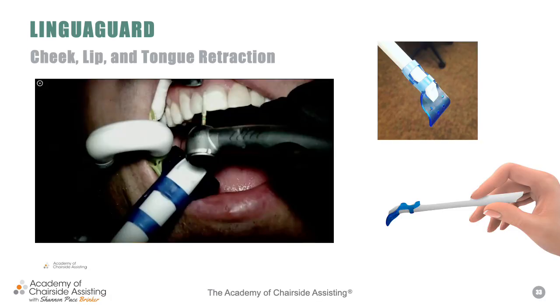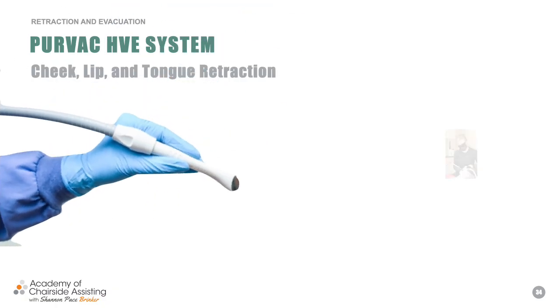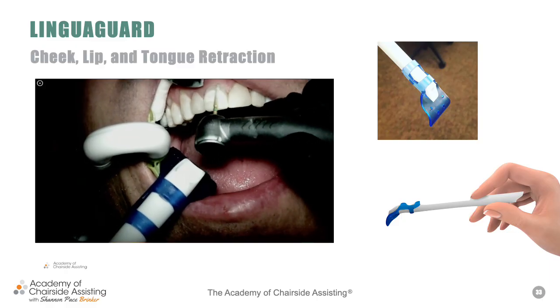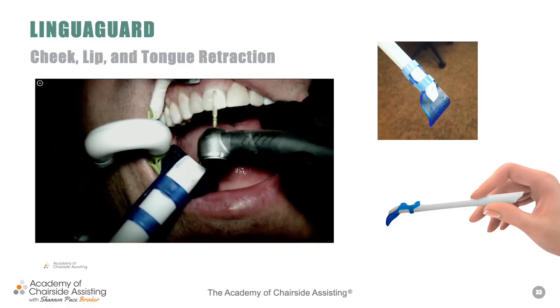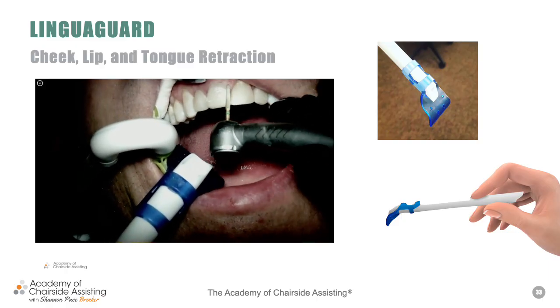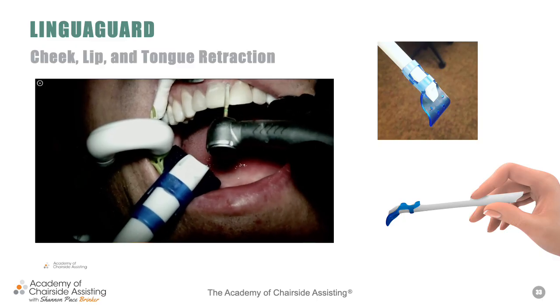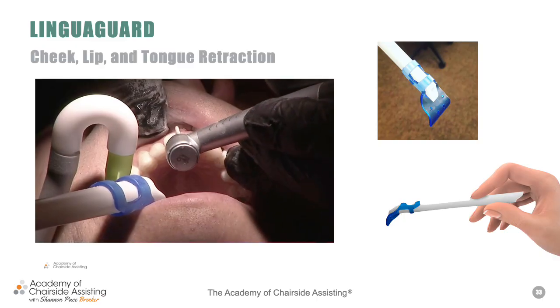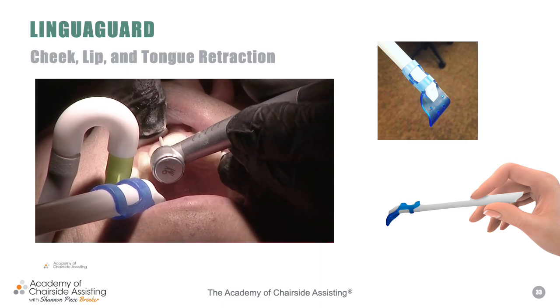Now, let me give you another scenario here. You can see that it's a suction device with just that little end. Again, it's an add-on. Notice here in this video, I'll show you. Let me go back here again with it. I am utilizing that little area as Dr. Milner, a left-handed dentist, is prepping number 8, and I'm not going to be in his way because we're utilizing another suction device and a cotton roll, right? It's like, hey, 3 in 1.